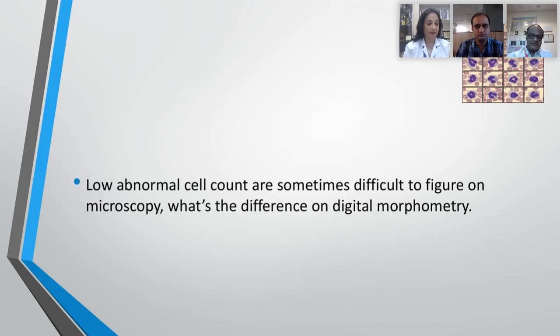I'll give you a simple example, not of a leukopenic sample. This was a sample from a liver failure in a COVID patient. When we put the smears under the CellaVision, we were able to pick up what are called suspected blue-green crystals of death, which is one of the most critical and very abnormal WBC inclusions that we have to tell the clinician. So we had to correlate with other parameters and tell the clinician: look here, doctor, we are seeing suspected blue-green crystals as inclusions in the WBC.